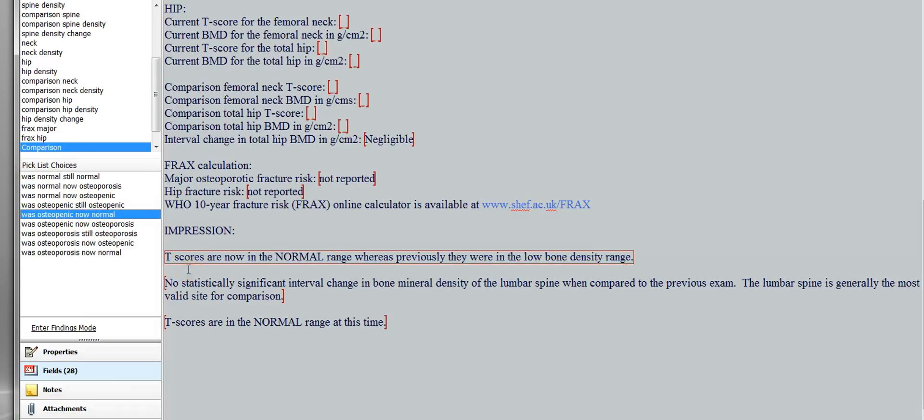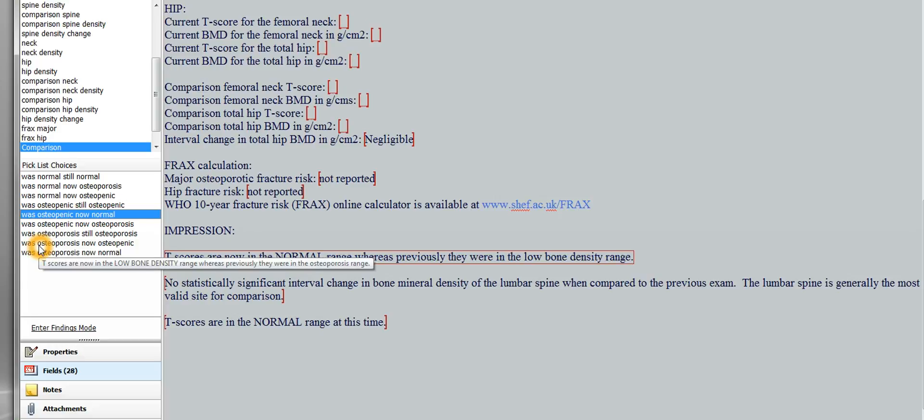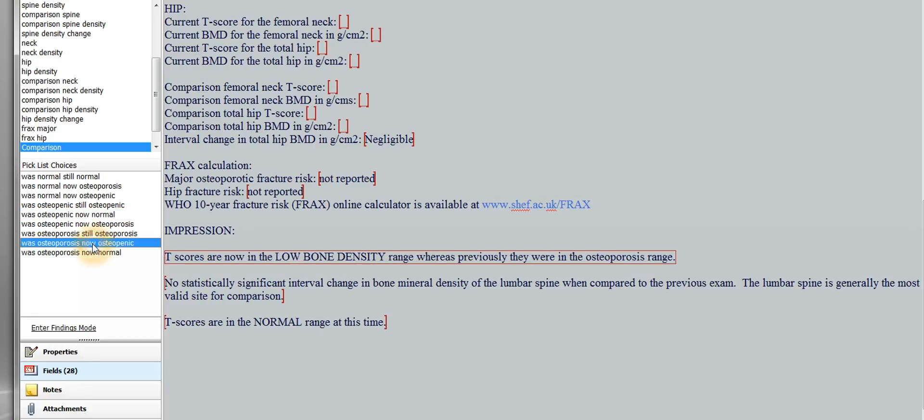Then the correct verbiage will come out. T-scores are now in the normal range, whereas previously they were in the low bone density range. Or here's another example. Say the patient was osteoporotic and now is osteopenic. Double click that one. It'll say T-scores are now in the low bone density range, whereas previously they were in the osteoporotic range. So that's impression number one.